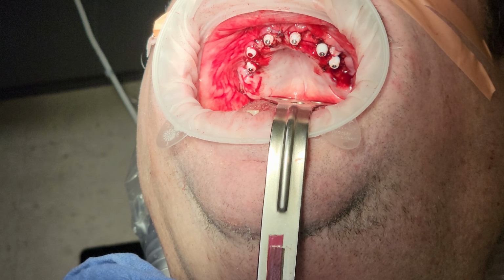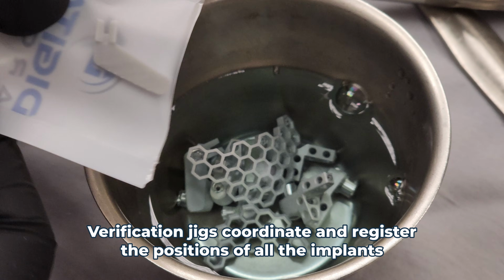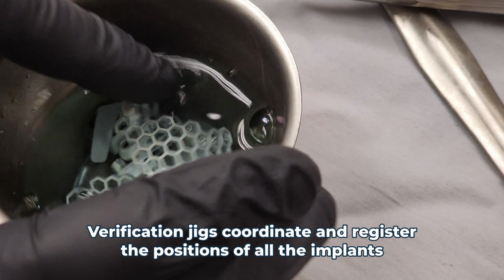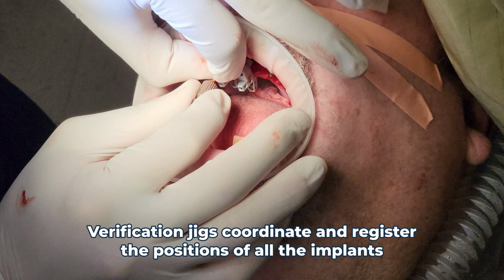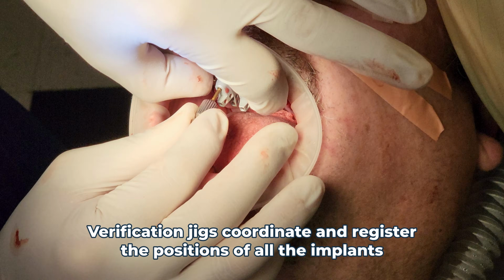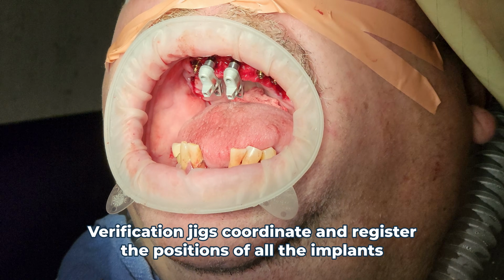Okay, so now another important thing to know is that to be able to fabricate the implant dentures or do anything while the patient is not around, we have to know the exact orientation of the MU abutments and the implants. And we need to be able to scan that into our software so we can superimpose all of our current positions of the implants over the past ones and for the future ones as well. And once again, this has to be exact. So to do this, we need to make what we call a verification jig that coordinates and registers the positions of all the implants in their MU abutments. We specifically use a device here called OptiSplint to make this verification jig.